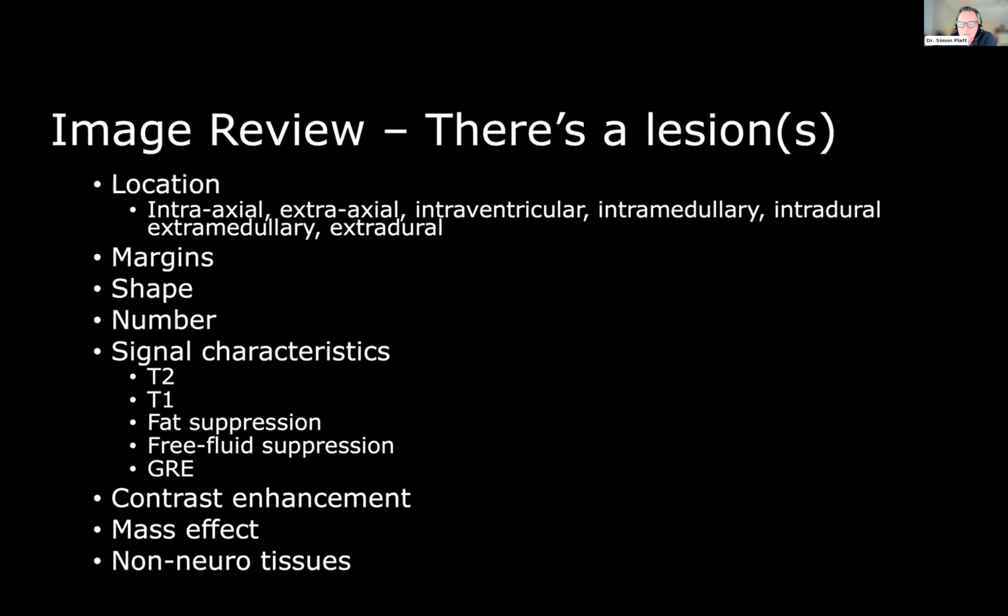And so you make a good point with the satisfaction of search, which I'll speak personally, I definitely have been guilty of. Finding a lesion seems to fit the clinical signs and everything we've thought about with respect to differential diagnosis. Is there something that you do to try to avoid that satisfaction of search, just stopping right there when it does fit all of the criteria, or is it just a case of must continue to look, make sure you're thorough on every image set?